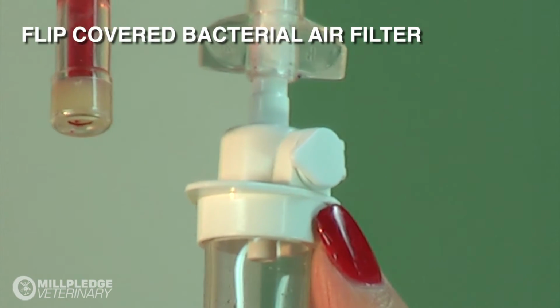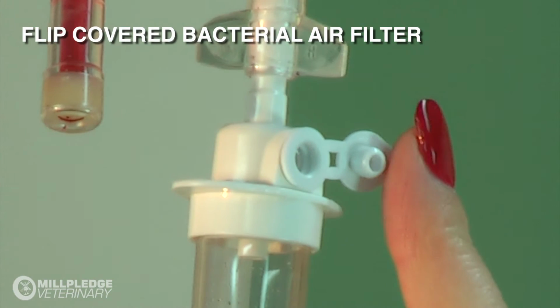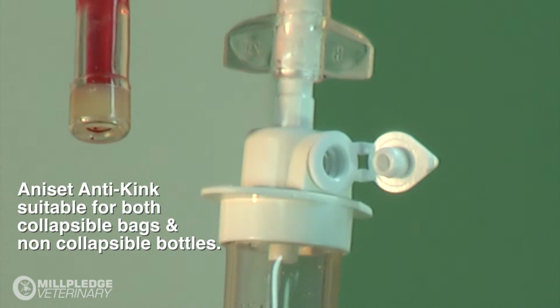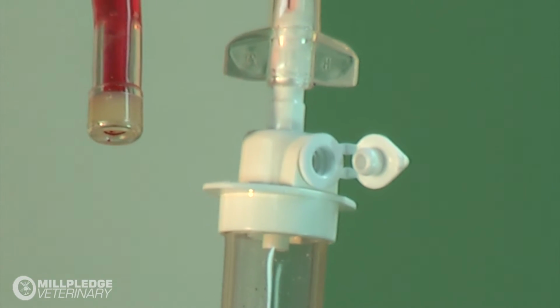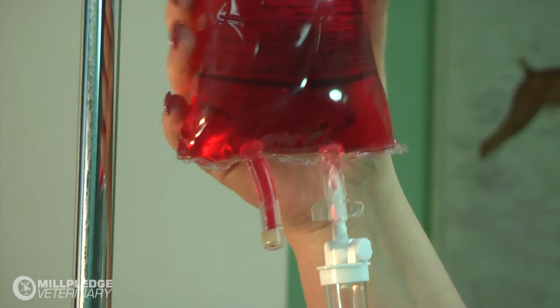Next we have a flip covered bacteria air filter. When opened, this releases the vacuum, allowing the fluids to run through. This cap should be opened when using non-collapsible bottles such as glass or hard plastic. There is no need for this to be opened when administering solutions from a flexible IV bag.